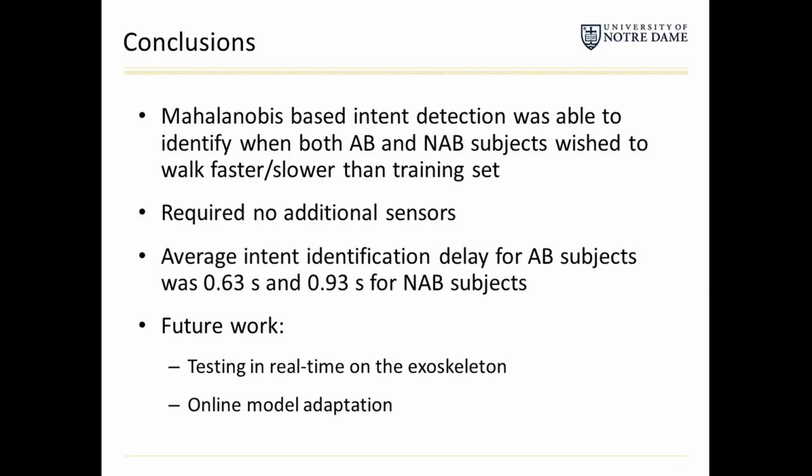Future work will involve testing the algorithm in real time on the exoskeleton, as well as allowing for online model updates so that the model can acclimate to new steady-state walking patterns.